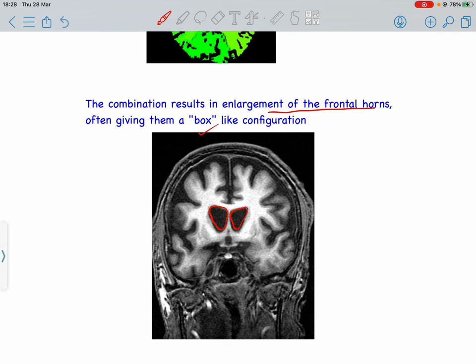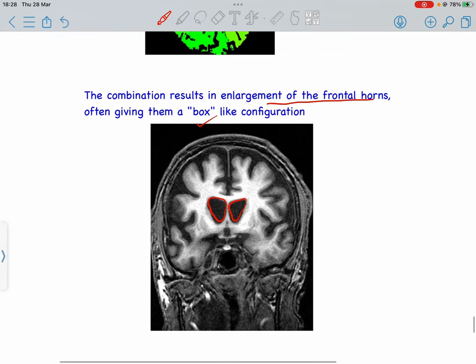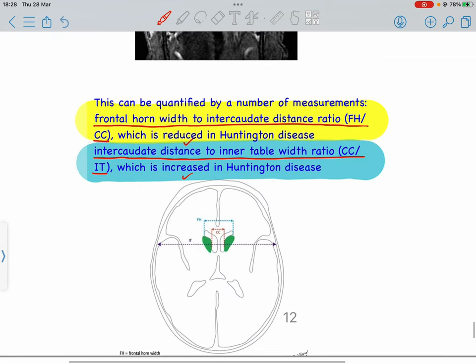These findings can be quantified by measurements. The frontal horn width to intercaudate distance ratio (FH/CC) is decreased in Huntington's disease. Similarly, the intercaudate distance to inner table width ratio (CC/IT) is increased in Huntington's disease.